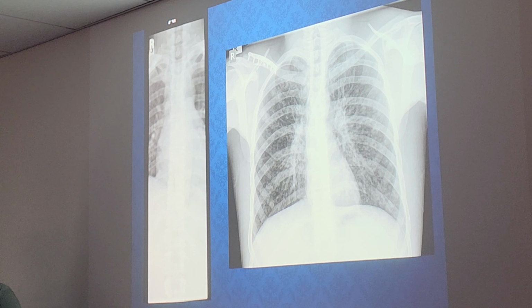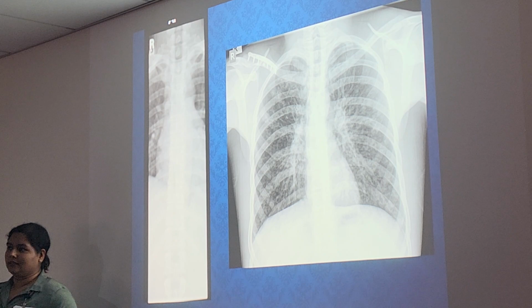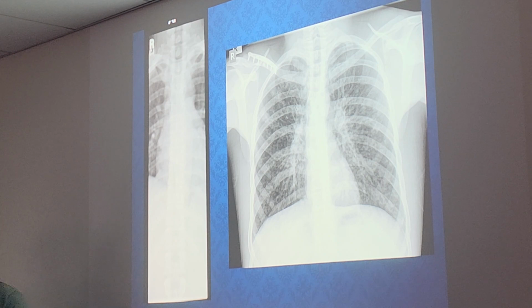I don't know if there's any particular reason why. Mr. Fong, do they say to use the right marker? A particular reason to use right marker? The only thing that I can think of for pelvis, abdomen, is because most of the time you're closer to the patient's right side. Try not to reach over your patient. Yeah. And for chest, we were told by Mr. Fung that it's better to use the left, because you're gonna use lateral for the position.